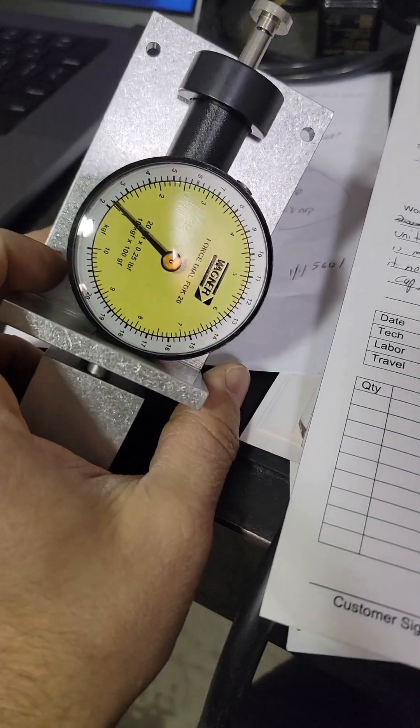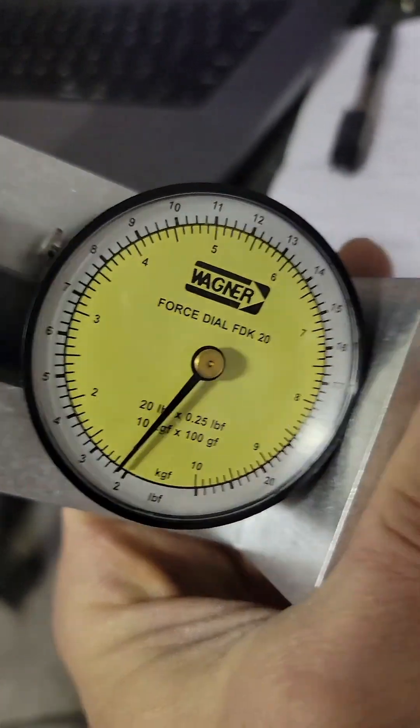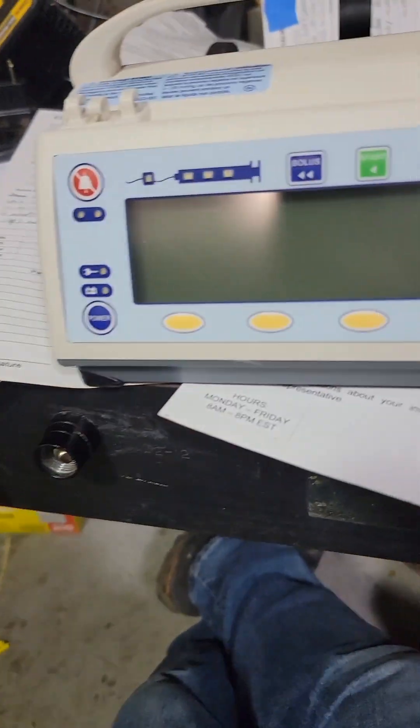These are currently a pain to hunt down. You can try the manufacturer Wagner — there's your part number — but this is on back order.